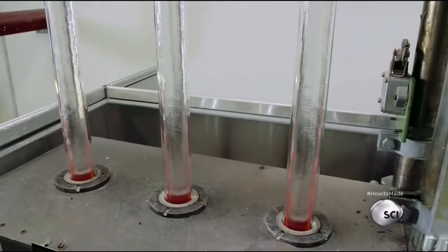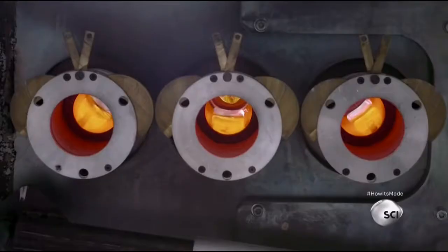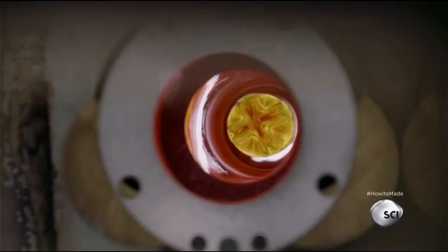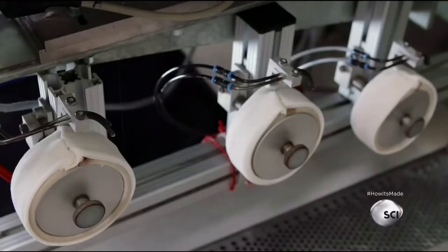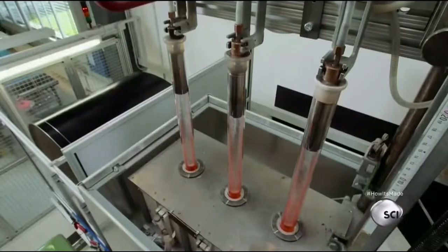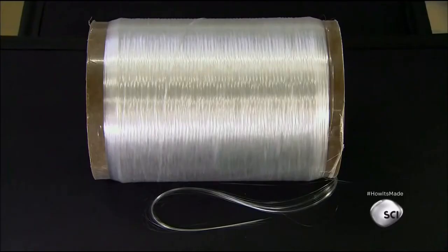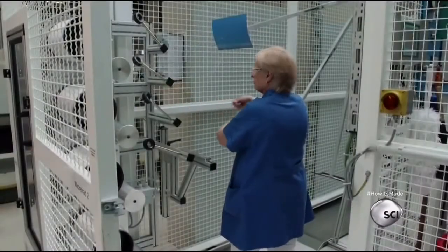The optical fiber manufacturer suspends glass rods from the top of a tall oven, which heats them to a melting temperature of 1652 degrees Fahrenheit. Each rod drips downward in the form of a thin strand. A guide wheel turns this glass fiber in a horizontal direction. The fiber then winds onto a drum, whose rotation speed stretches it to a specific hair-thin diameter.